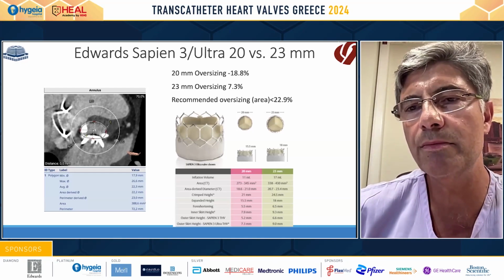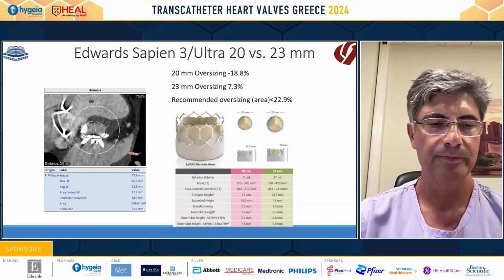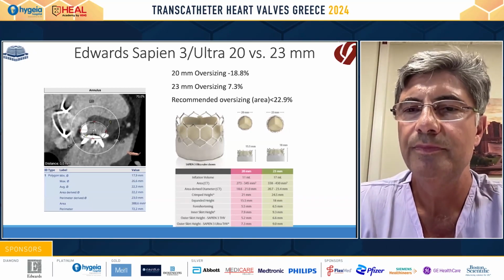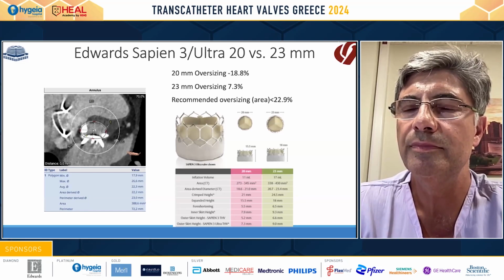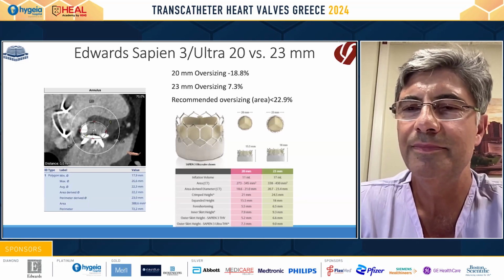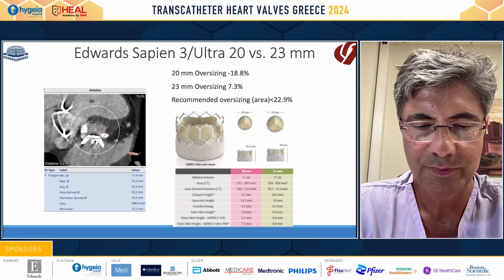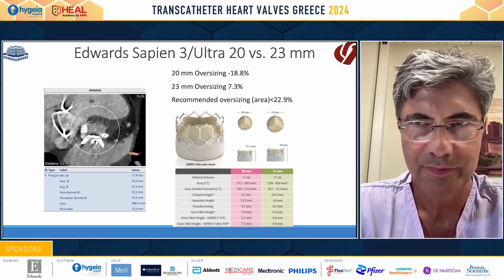Any comments from the audience, from Dr. Dimas? Yes, Dr. Kilic. Can I have a microphone, please? Hi, Yannis. I am Dr. Kilic. Very good case. Did you measure fluoroscopically also the distance between the valve and the mitral valve?